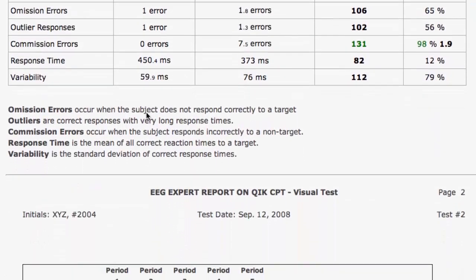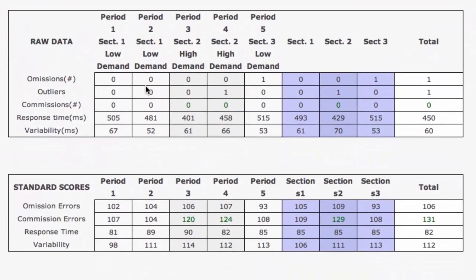Let's move down the report. This section breaks out the numbers you've already seen and breaks them into the five periods and three sections. There are two slow sections, two fast sections, and a slow section — slow, fast, slow. It feels like the test is getting faster or slower, but actually what's happening is stimulus infrequent in some sections, so there's not a lot of targets, and then stimulus frequent with a lot of targets to press. This gives us a great opportunity to see how people handle getting in and out of a new task, how they handle sustained performance in the high-demand section, and how they handle the transition into the next task.